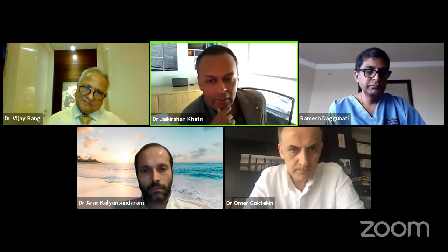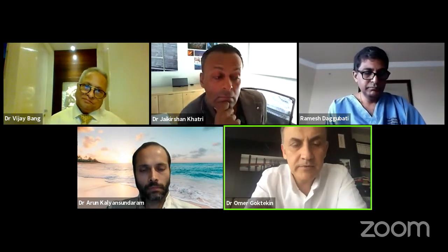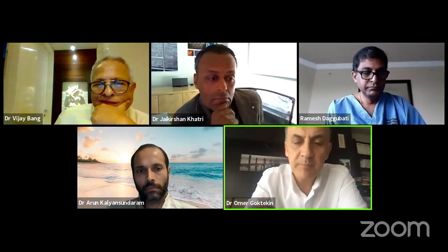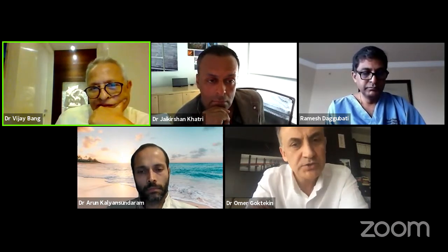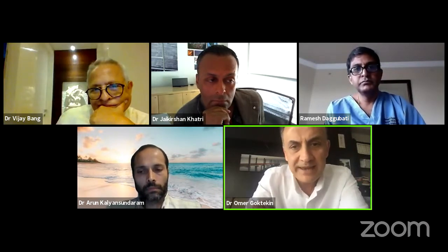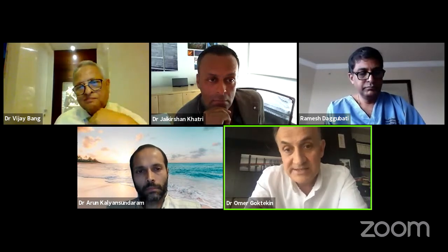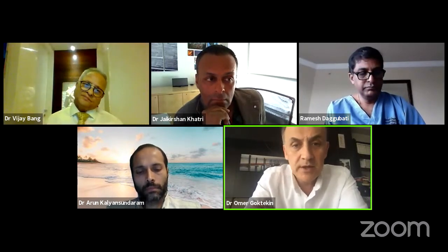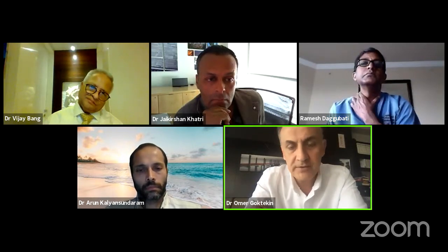We do have it in the case, but quite often we're not even looking at it, to be honest with you. Okay. I fully agree with Jake. Vijay? Yeah, I think pre-planning is very important. Very useful. During the procedure, we use it if we have an ambiguous cap, for example, LAD ostium, if we don't see LAD ostium or RCA ostium. In that case we use it. But it's not that helpful for co-registration purposes. I agree with Jake, 100%.